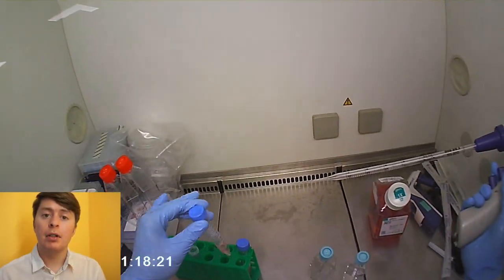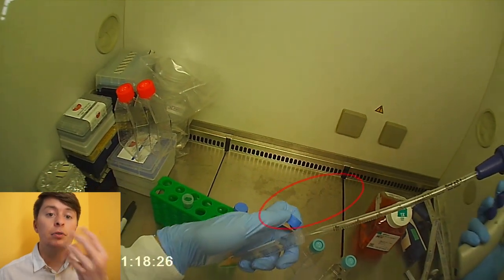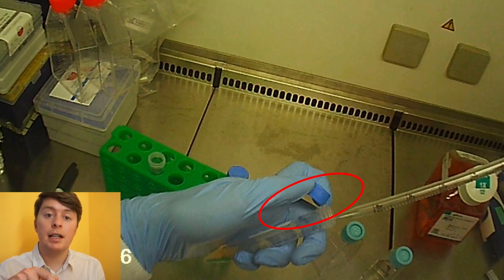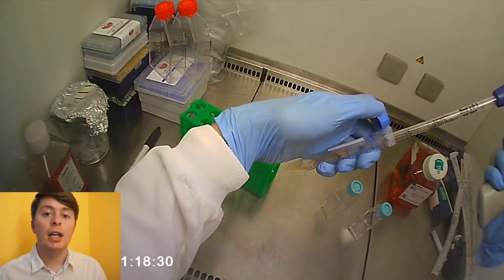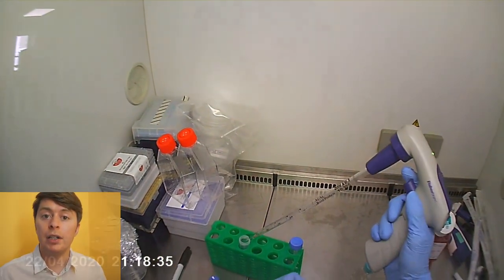So one of the key things which I somewhat glossed over, using aseptic technique, is that when you're unscrewing the cap on a Falcon tube, you don't put the cap down. Or if you do, you put it down so it's not face up, so you don't put the screw part of the cap facing upwards. That's because bacteria can deposit inside that screw lid. I have enough dexterity in my hands that I can hold the lid whilst pipetting in and out. But some biologists prefer to just put the lid down. It's out of the way, and you can easily pipette in and out of that Falcon tube. Either's fine because the cell culture hood should be completely sterile.